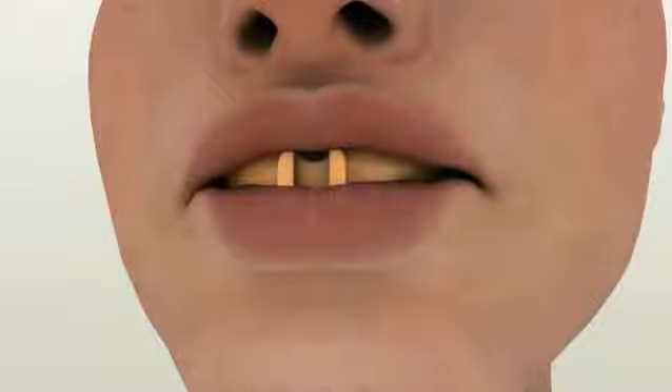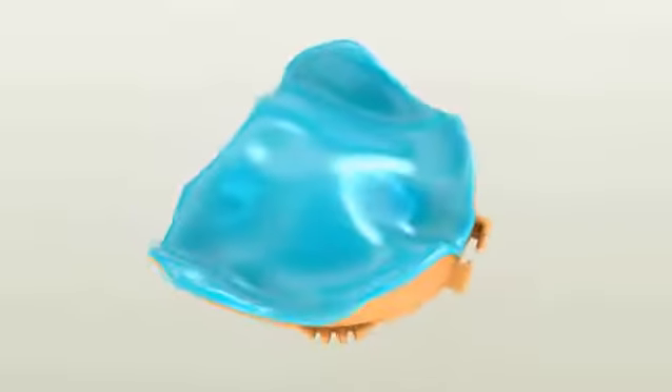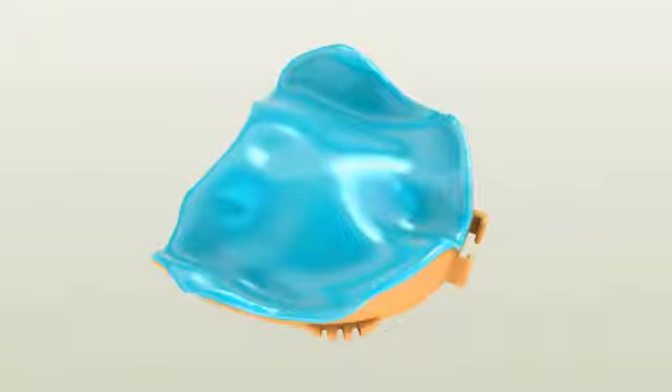Repeat these border molding movements three to four times until the material is set completely. Setting time varies between manufacturers, so please check your PVS impression material instructions. Once the material is set, remove the tray and check the impression. There are two areas you need to check: first, the edges of the DENTCA tray should not be visible through the impression material.